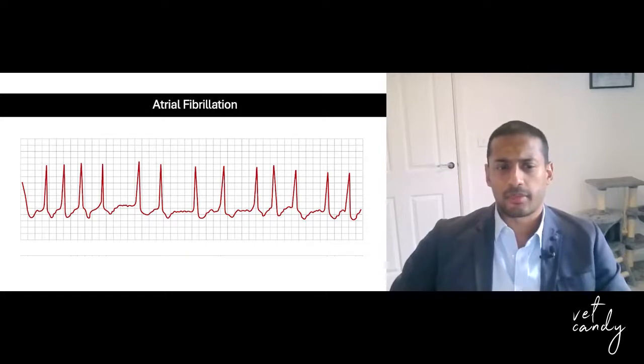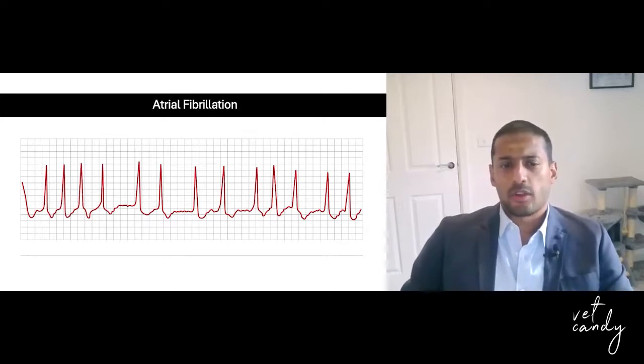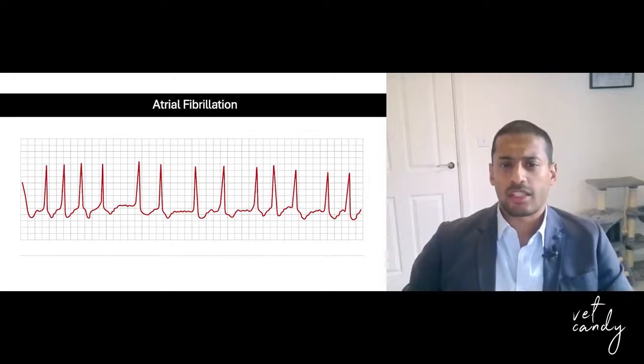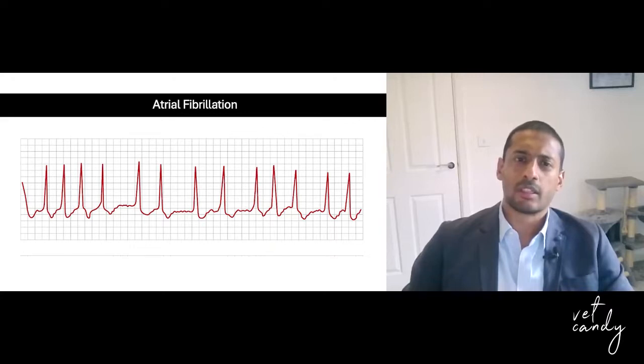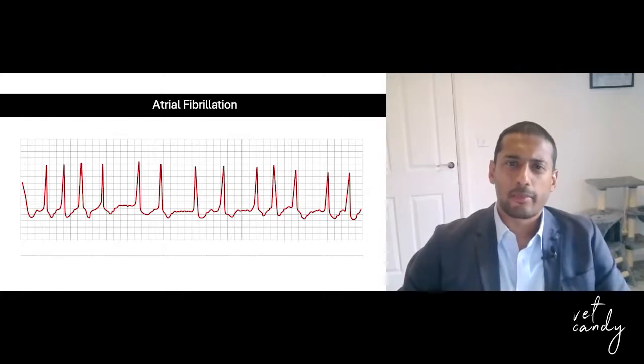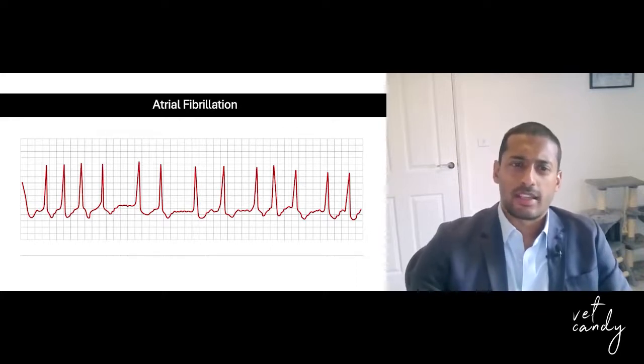of cardiomyopathy. In atrial fibrillation, rather than atrial depolarization being controlled by the sinoatrial node, there is constant random activity throughout the atria, which causes intermittent and variable AV node conduction and ventricular depolarization. Patients with atrial fibrillation have a pretty typical auscultation. The heart rate is totally irregular, often pretty fast, and there are pulse deficits. The faster the rate, the more variable the pulse quality, and the greater the discrepancy is between heart rate and pulse rate. The ECG in atrial fibrillation has a characteristic appearance with three important findings.